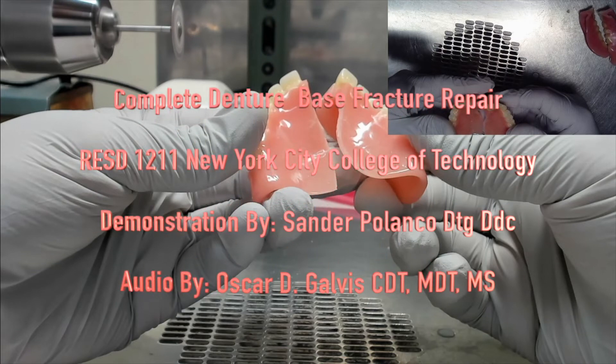Hey everybody and welcome back again. This is the Complete Denture Base Fracture Repair instructional video for the Complete Dentures II course at New York City College of Technology. This demonstration is done by my friend and colleague Sander Polanco, while the audio is done by me, Oscar Galvis. So let's begin.